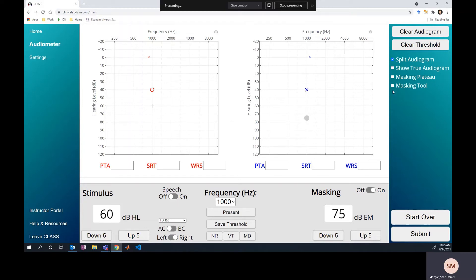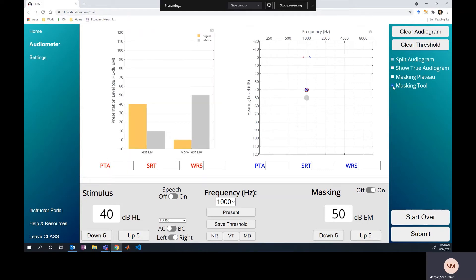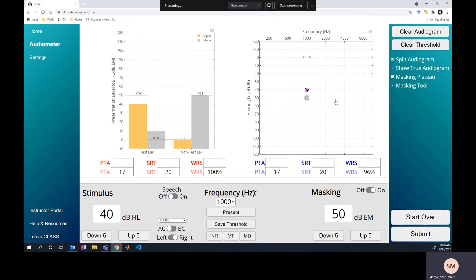Let's talk about what's actually going on here. I'm going to show the true threshold using the masking tool so we can see what we're working with. We decided the correct starting level for masking is 50 dB. That 50 dB masker signal is crossing over, being attenuated by 40 dB interaural attenuation, and being heard in the test ear at about 10 dB HL.